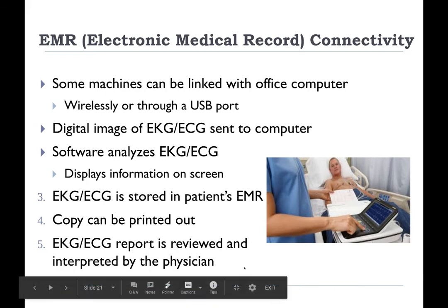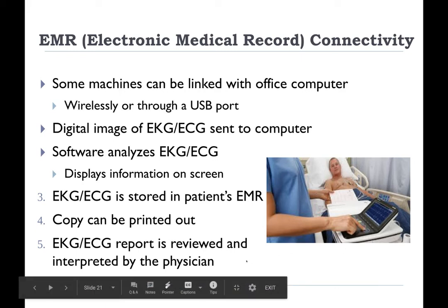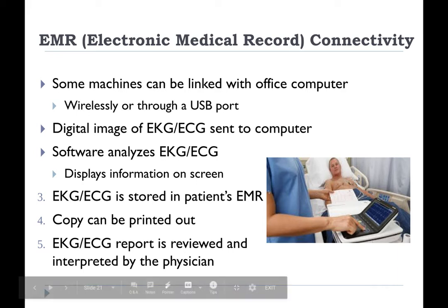And the report is reviewed and interpreted by a physician. Depends on where you are. Sometimes it might be just the ordering physician. You would perform the EKG and then just give it back to them or send it to them to review. Where I work at PAMF, actually all EKGs get reviewed by a cardiologist, and they make the final interpretation. And when they do that and result it, it gets sent back to the ordering provider so that they can use the results to diagnose or treat their patient.